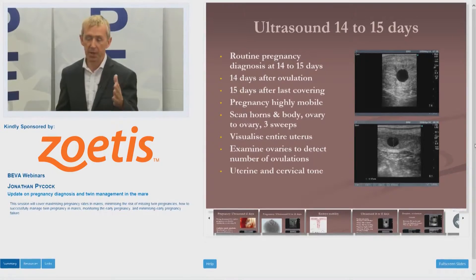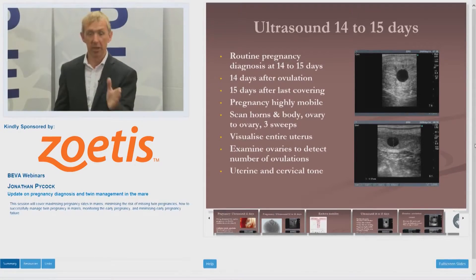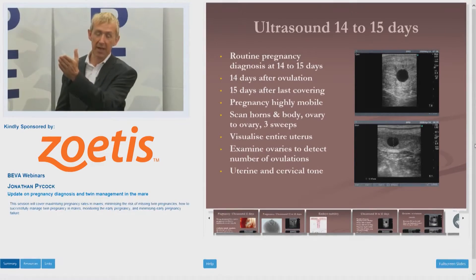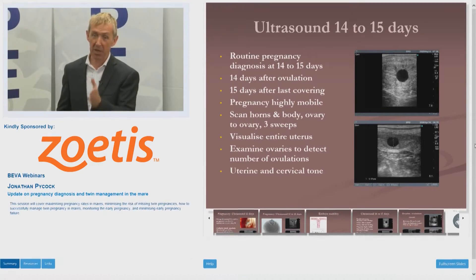Scan both horns and do this slow sweep. I always start with the left horn — it doesn't matter, you can start with left or right, but have a routine. So: left ovary, left horn, down the body, right horn, right ovary — then you repeat the whole thing three times. That's what we always do in our practice, and over the years we don't miss many twins.